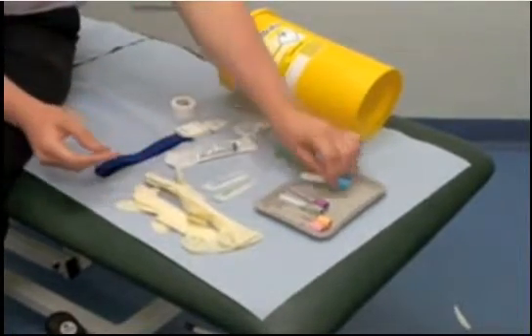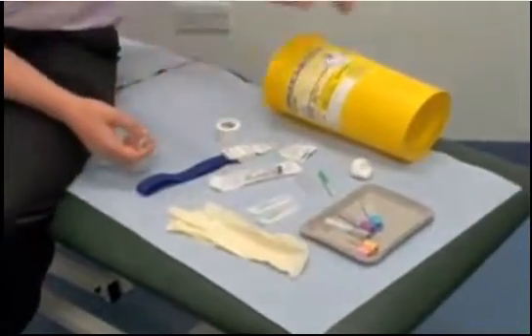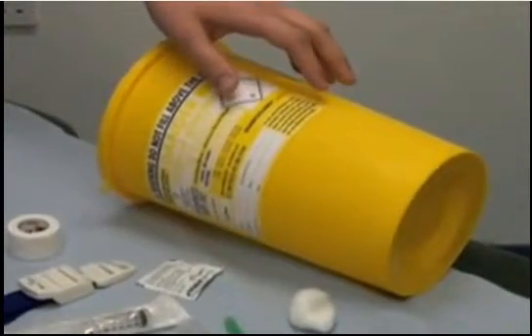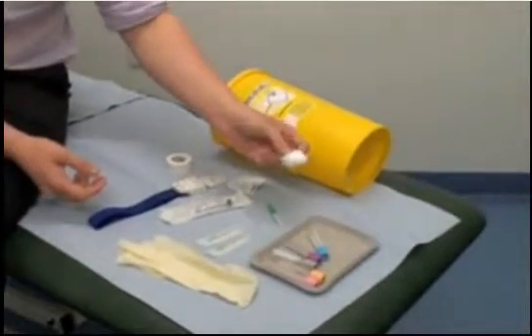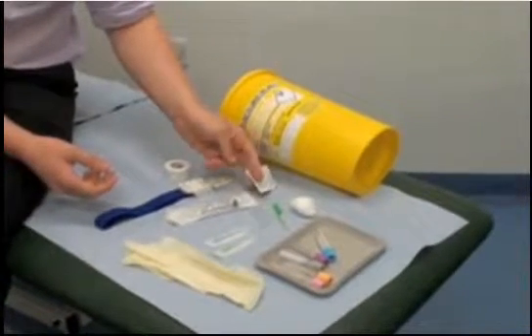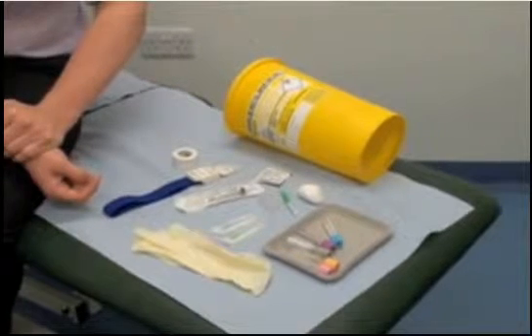It's always important to protect yourself. You'll need gloves to protect against blood-borne infection, a sharps bin so you can dispose of the needle immediately after use — again to prevent needle stick injury — a cotton ball and tape to secure to the patient, and an alcohol swab to clean the patient's skin before taking blood, to avoid introducing infection.